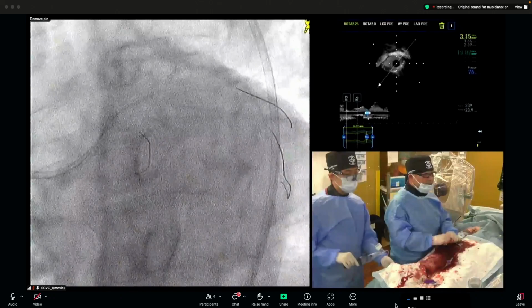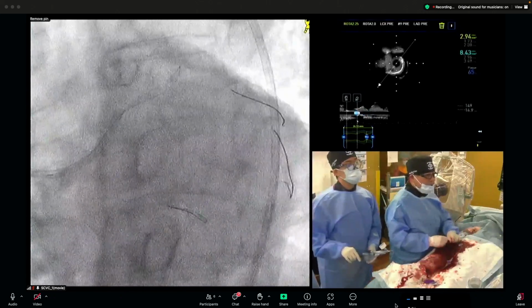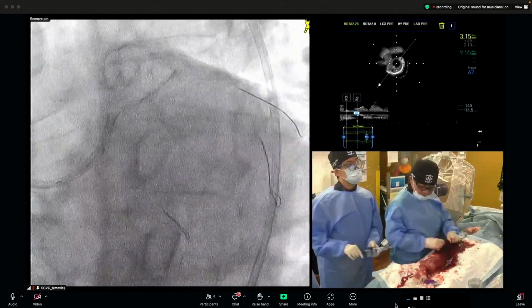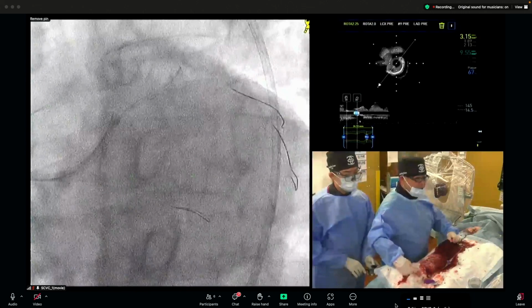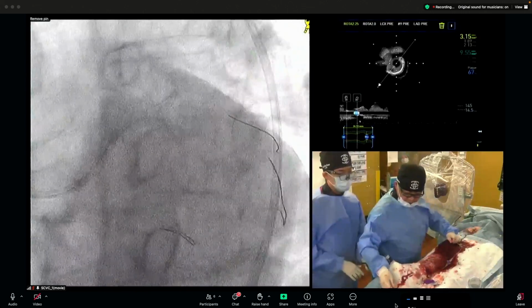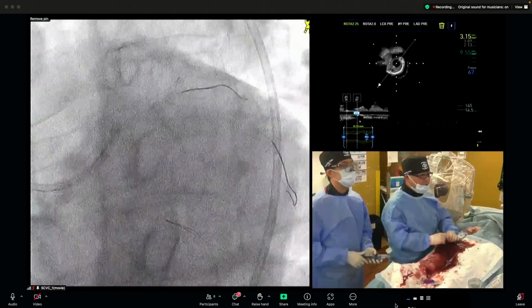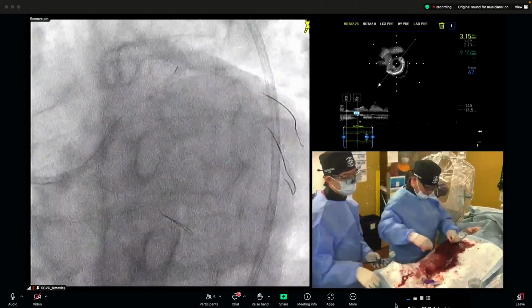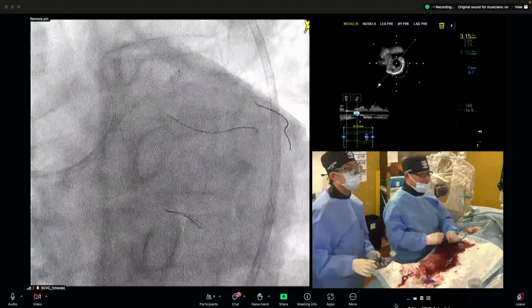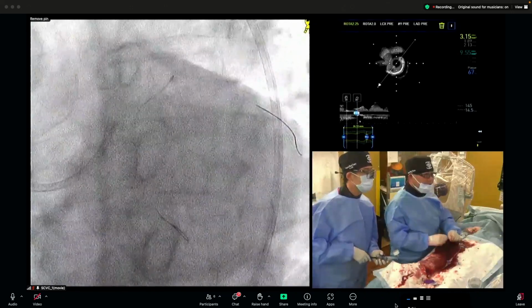Most frequently, we undersize the stent at the bifurcation, and the end result is under-expansion of the stent at the bifurcation, not side branch compromise. Usually this is not my practice, but I learned from Dr. Kashima that with aggressive debulking, you may expand more aggressively at the point of bifurcation. But the clinical implication, I'm not sure.